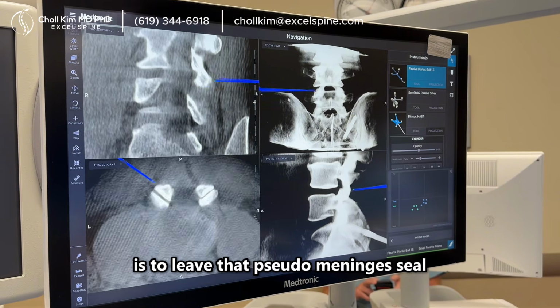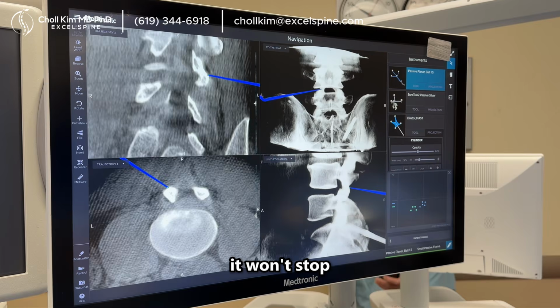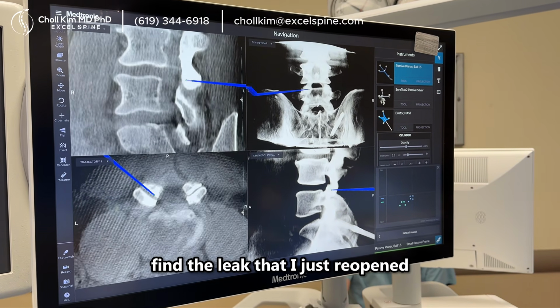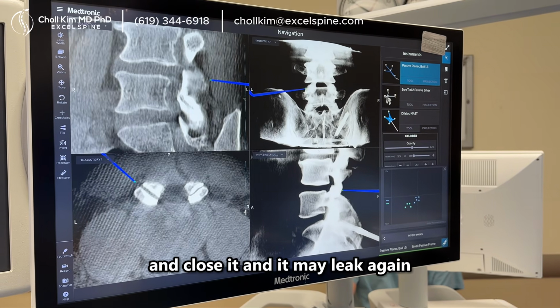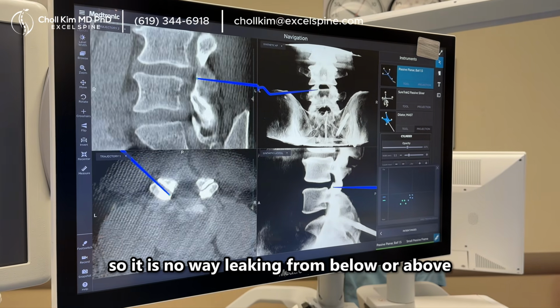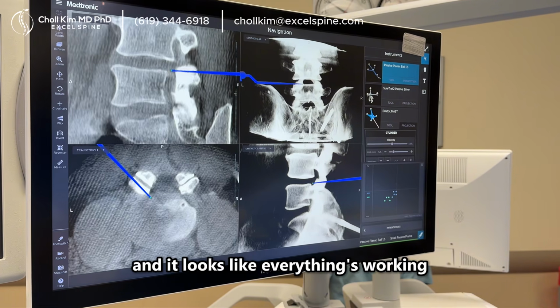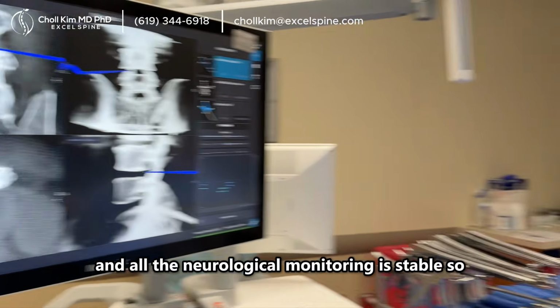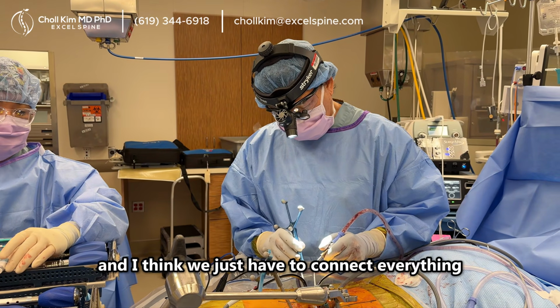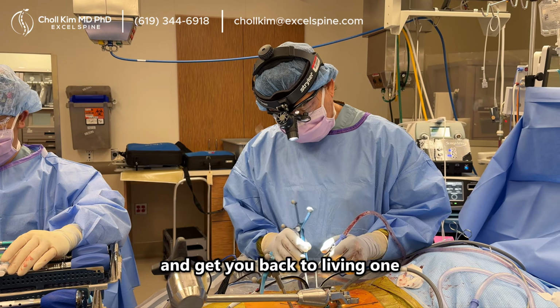So I think the best thing to do is to leave that pseudomeningocele, because if it starts leaking and won't stop, I'll have to completely resect all this tissue, find the leak that I just reopened, and close it, and it may leak again. So there is no way it's leaking from below or above. And it looks like everything's working and all the neurologic monitoring is stable. So I am feeling good. And I think we just have to connect everything and get you back to living your wonderful life again.